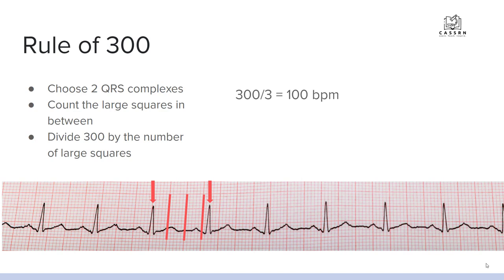You'll notice the previous method gave us 90 beats per minute, and this one gives us 100. The rule of 300 is a little more accurate because we're using a more finite method — counting something smaller. When you count in smaller increments, you get a more accurate number. Remember, this is only accurate if your patient has a regular heartbeat. If your patient has an irregular heartbeat, your numbers will be all over the place and not nearly as accurate.